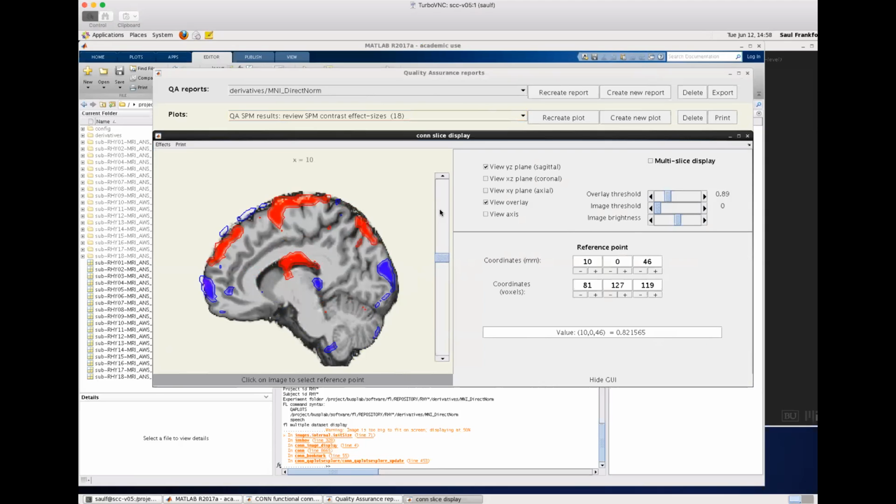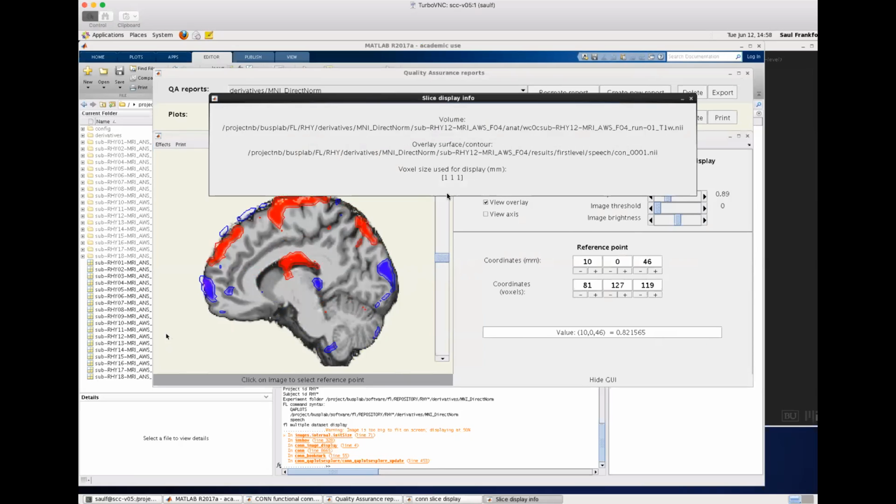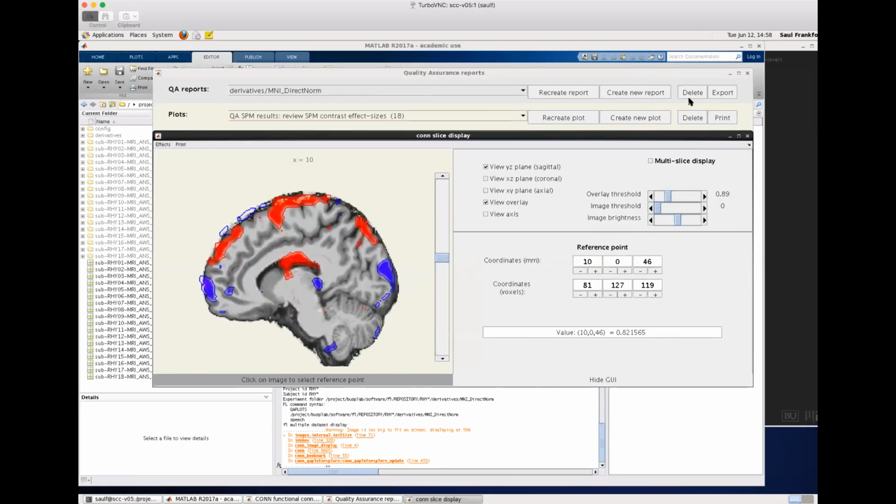But if you are doing surface-based analysis, then yes, definitely the quality of your structural also affects a lot the quality of both the normalization and the co-registration. So if the subject moved during the structural data, then that affects things a lot. In this case, for direct normalization, we are doing the actual direct normalization of the functional data disregarding the structural. So there are fewer things that could go wrong, basically.